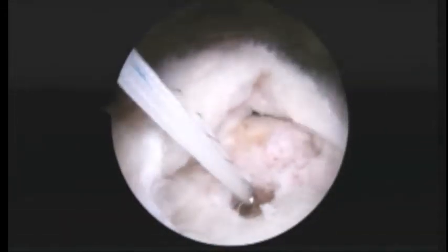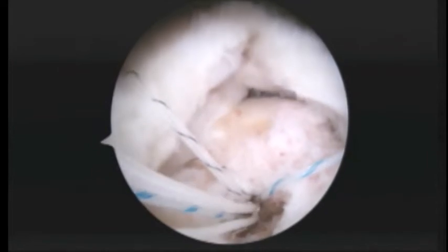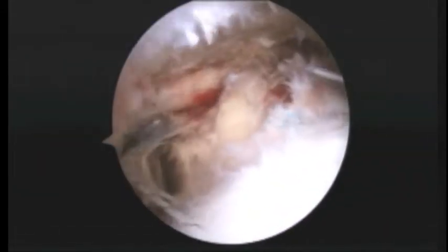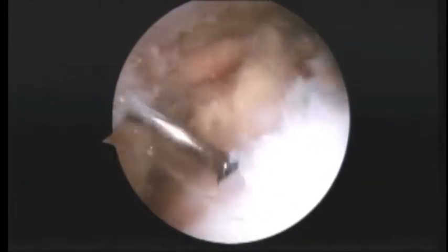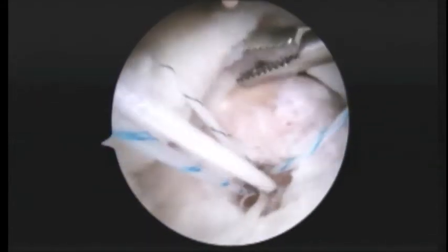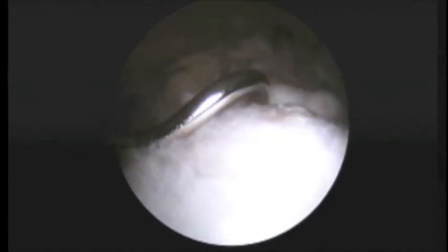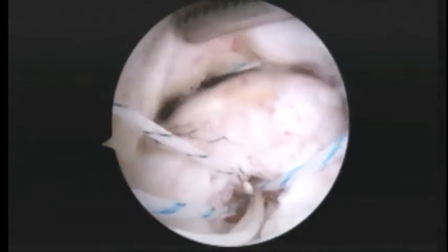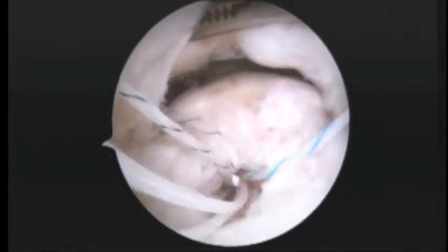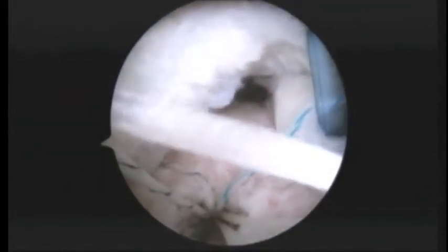Okay. Now we're going to take the next suture in line out the front, which looks like it's going to be the blue and white suture here. We'll make sure we don't unload the anchor. And now we'll take a turn to the right suture hook. There it is right there. Idea of how we pass our second stitch behind that ripstop suture. And we'll retrieve it here, show you some more in just a minute. Pause, please.